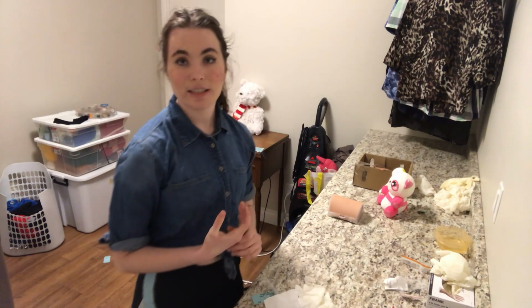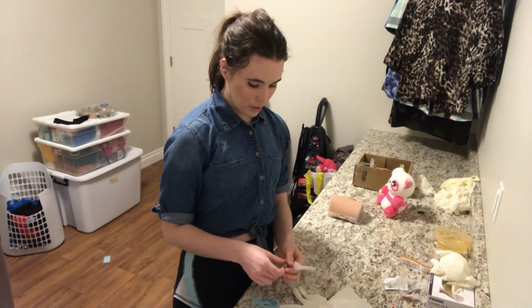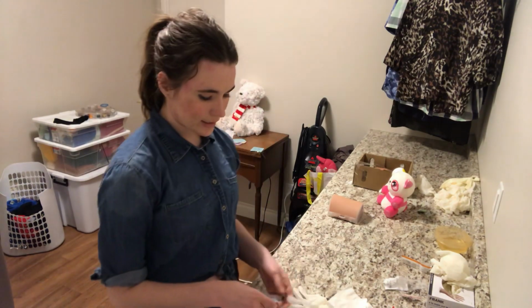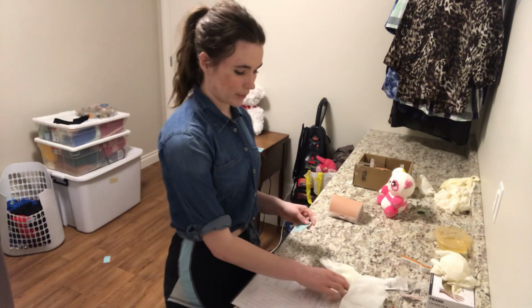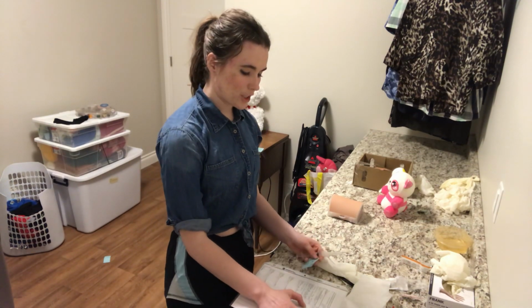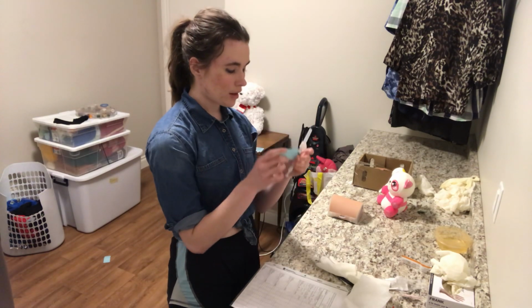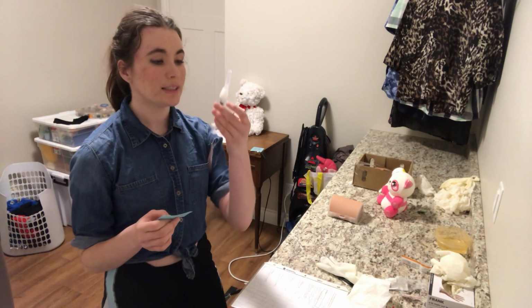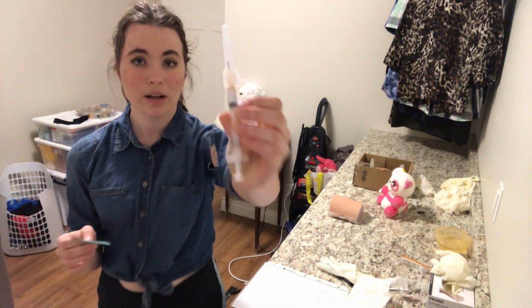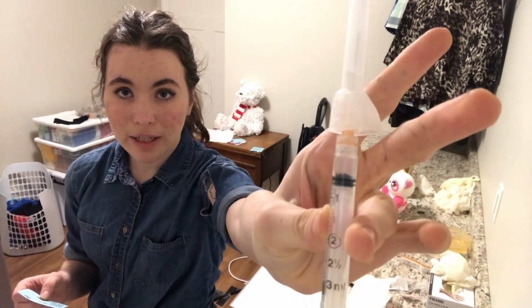So my patient consents to this procedure, so now I'm going to do my final check, where I'm going to compare my med and its label to my MAR. Can you see? Yep, there you go. So correct patient is Jake Nursing. Correct drug is heparin. This is heparin here. Correct dose is 5,000 units. It was 5,000 units per 0.5 ml, and I see that I've drawn up exactly 0.5 ml with no bubbles. So this is the right dose to give.